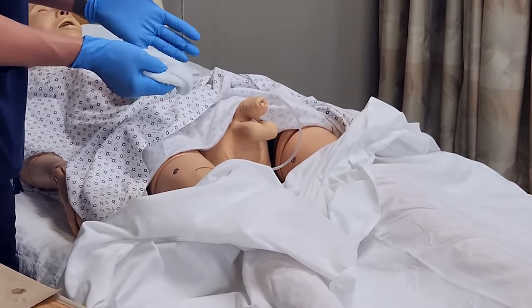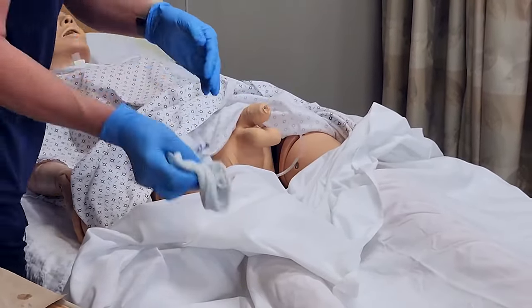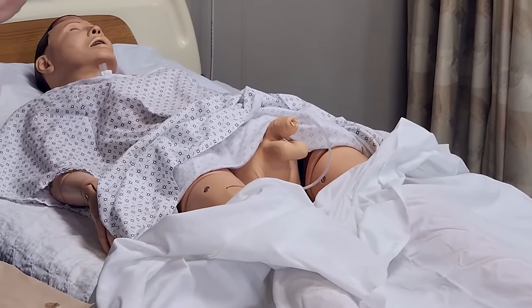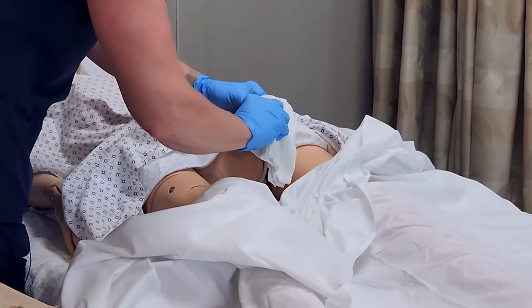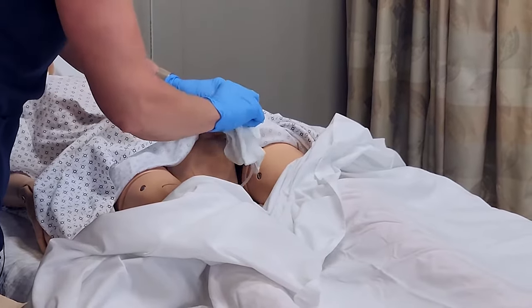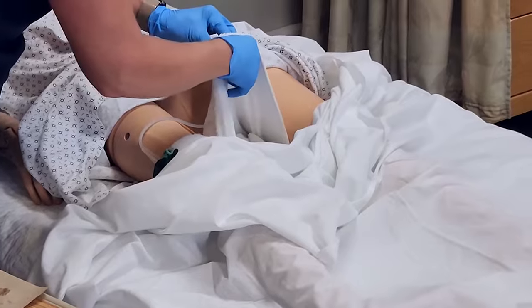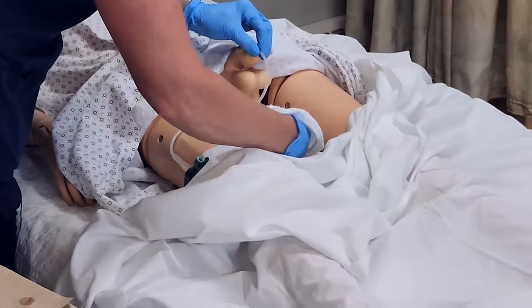You can also perform peri care at this time — you can refer to that video for specifics on that. I'll take my rinse cloth, also folded in four with my thumb at the corner, still holding the catheter. I'll rinse down at least four inches, as many times as needed to get the soap off, and then dry the same way using the towel underneath — holding the catheter and gently using two different parts of the towel.